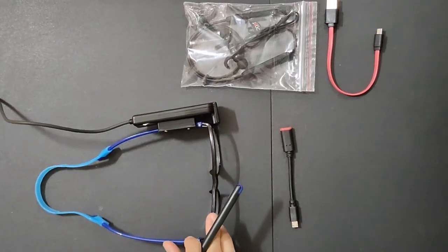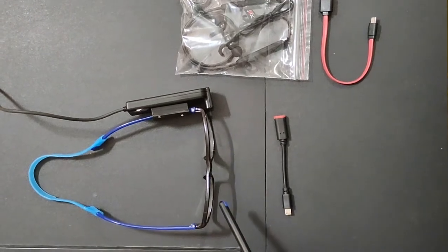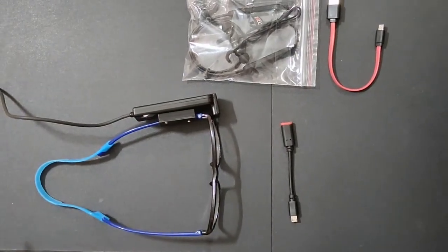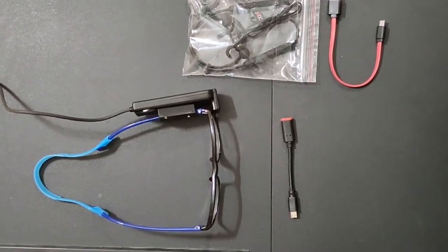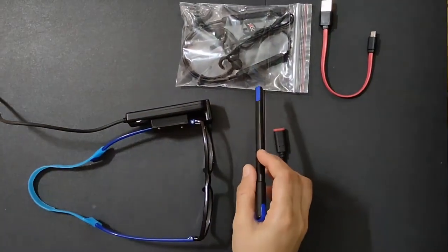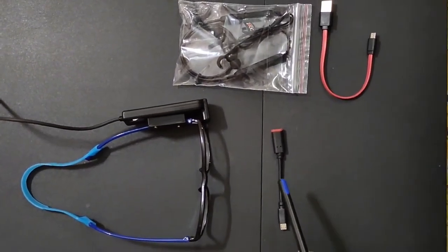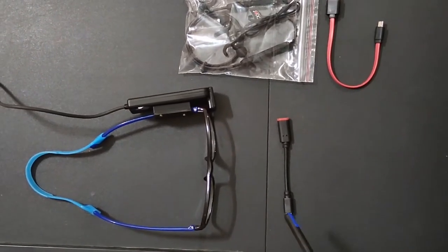This is the smart vision glass, which comes with a frame. The frame has plano glasses and there is a sensor attached on the left side of the temple. It is connected with a USB cable which you can connect to an Android phone or any smartphone. Along with this there is a Bluetooth headphone, a charger to charge the headphone, and a Type-C to Type-B cable, all available with this kit.